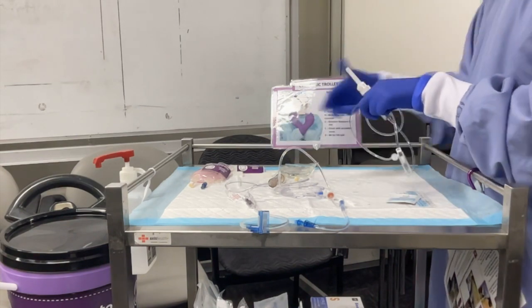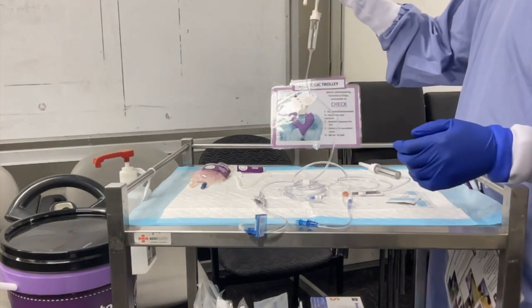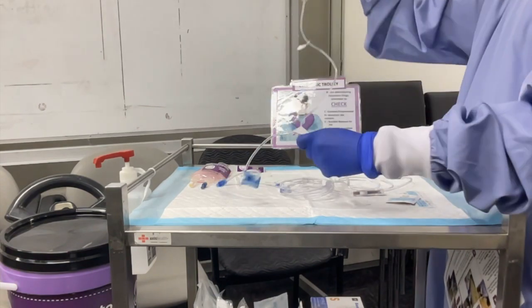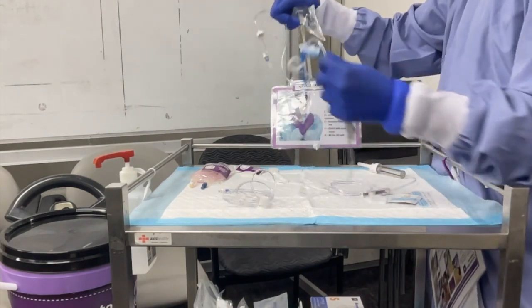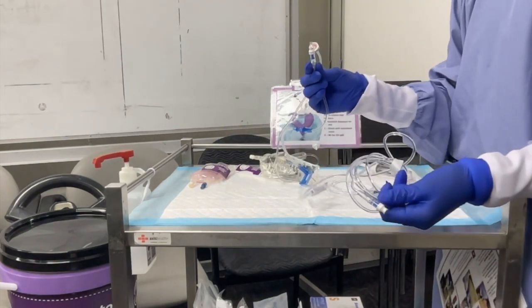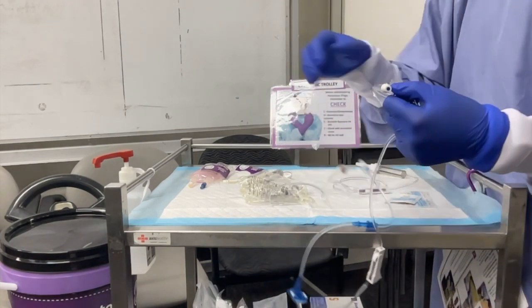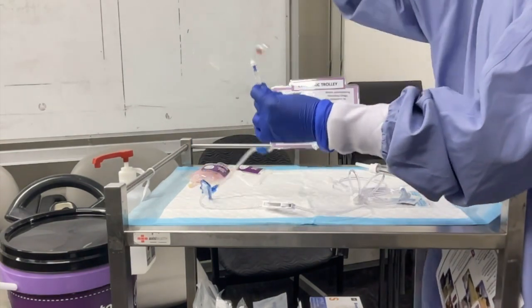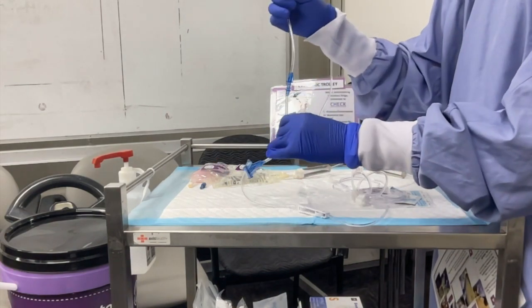All right, first of all, we're going to prime the fluid maintenance with the primary line, okay? So we're going to do that. Okay, beautiful. After we prime it, note that we have 2 hubs that we can connect medications to. The one above the Alaris pump, as you can see here, and the other one is closer to the patient side. When we establish the closed safety system administration, we need to use the one on top of the Alaris pump so that we can program it during the channel.